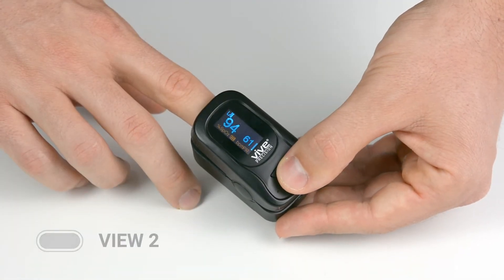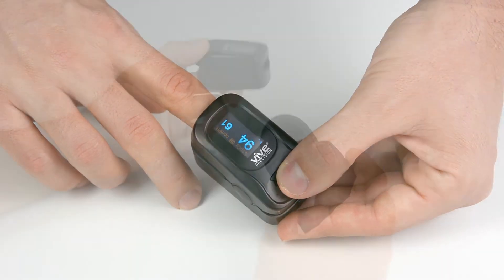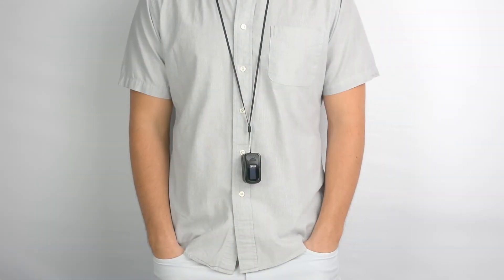You can toggle through four different display modes to easily read your measurements if you are taking readings for yourself or someone else. Your purchase includes a carry case and lanyard, perfect for professionals.